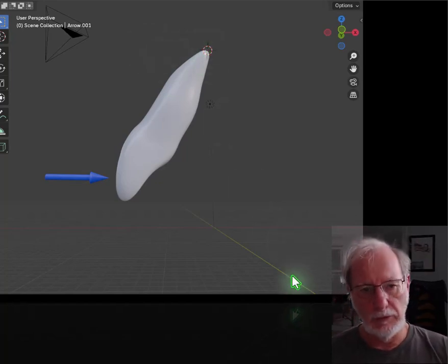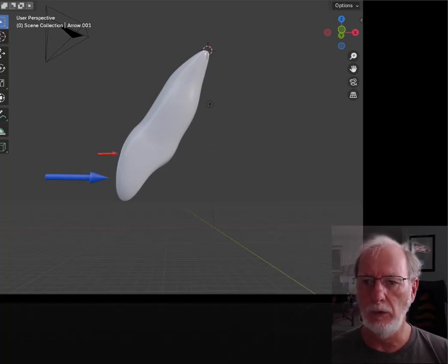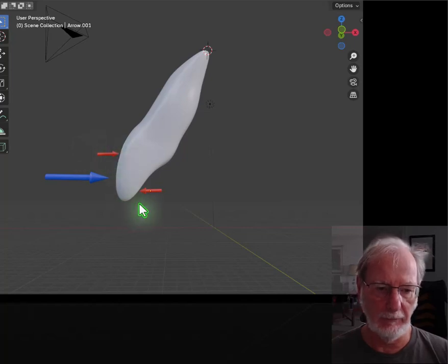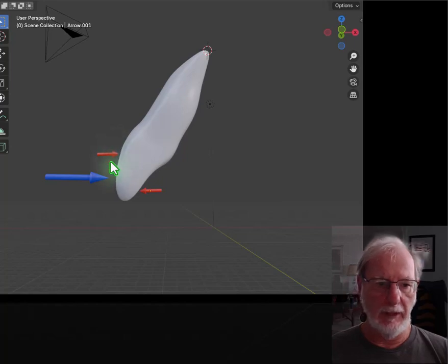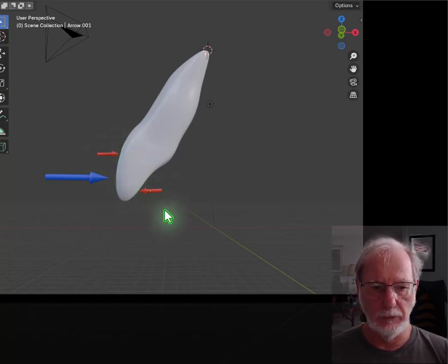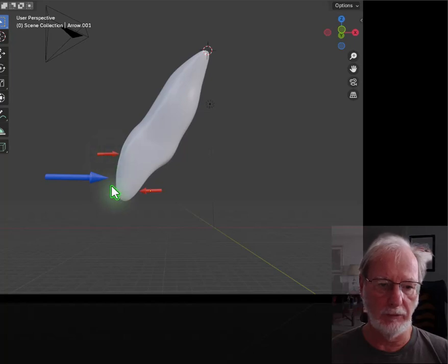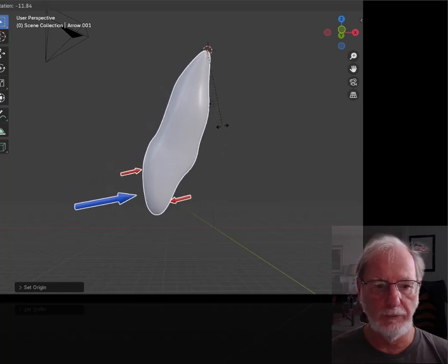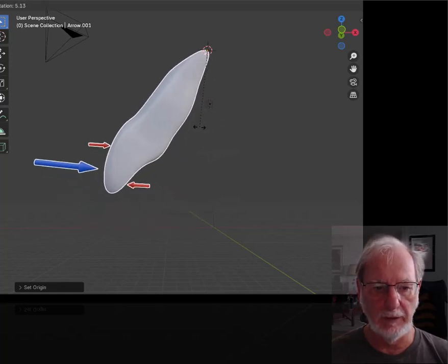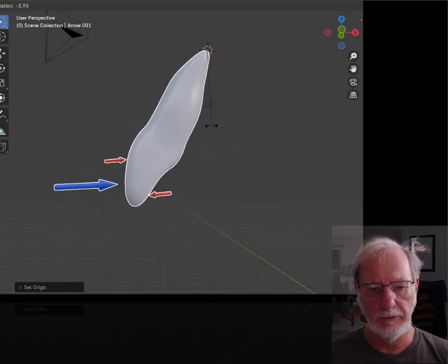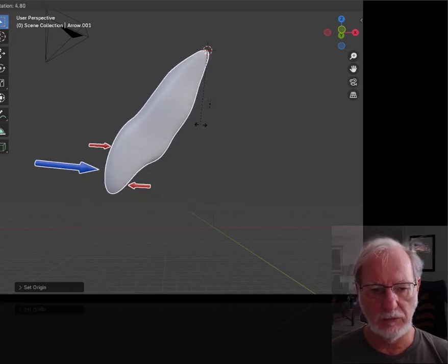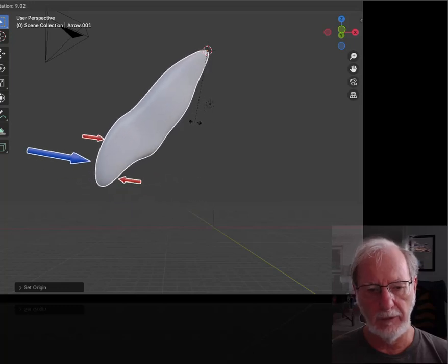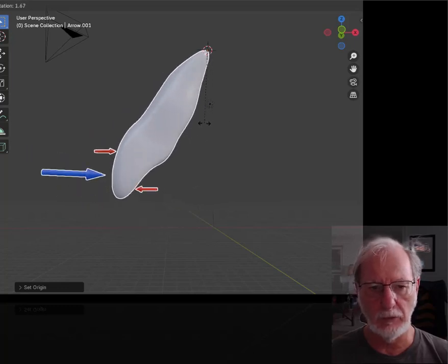We can change the force system and introduce a small force couple into the aligner, if we can, by putting some bumps or anything that will create these two little forces to create what we call a force couple. What will happen then is control tipping, where you can see the tooth is rotating around the apex, extruding also, and the crown is going exactly where we want. This is called control tipping.